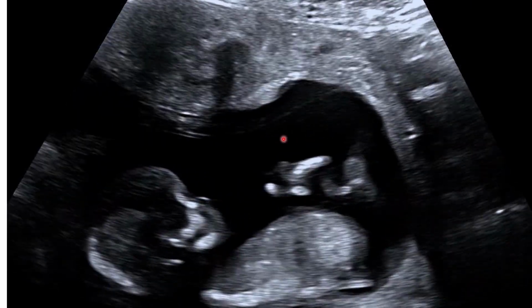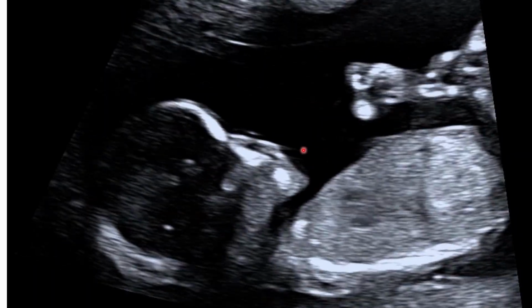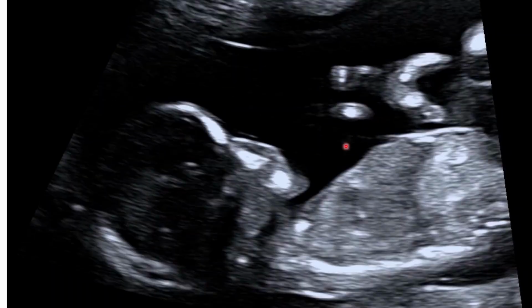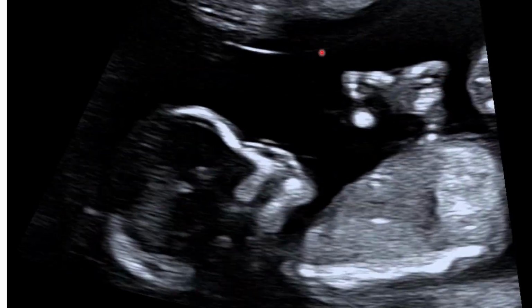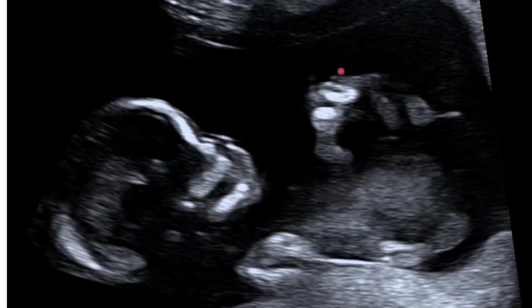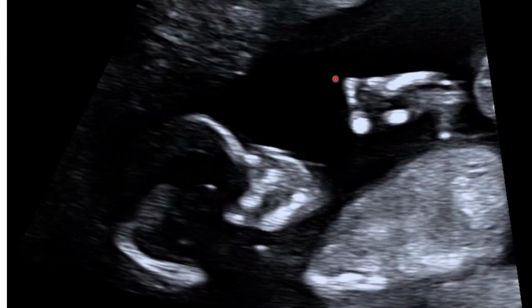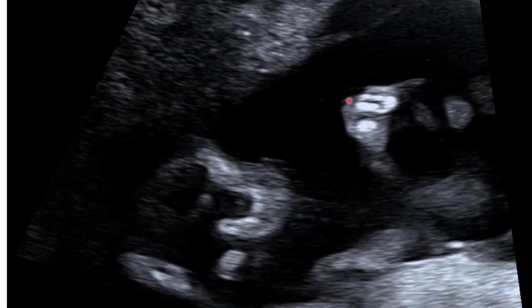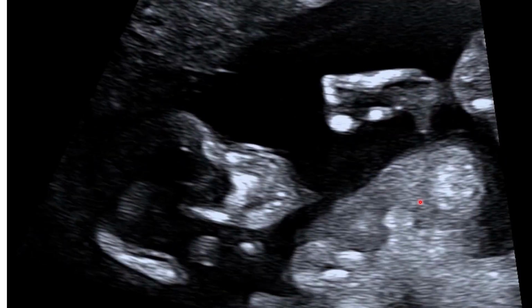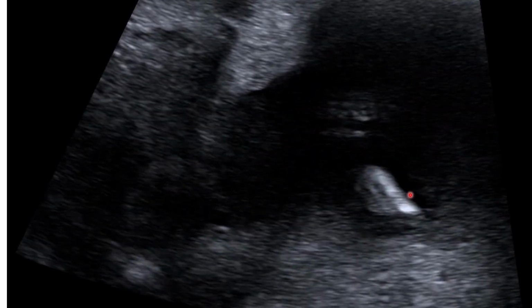So it's very advisable that before someone gets pregnant, they have to be checked for fibroids, and better if they can be removed before they get pregnant. This patient is lucky because this one is a small fibroid, it's not very big. So they just have to tolerate the pain, and the pregnancy is progressing, and we hope it's going to come nice without any other major complications.